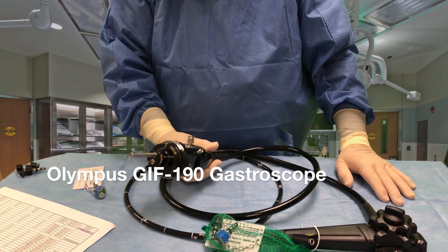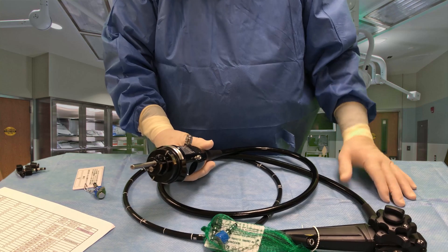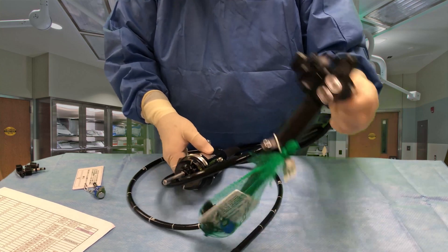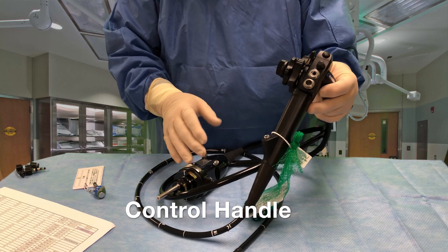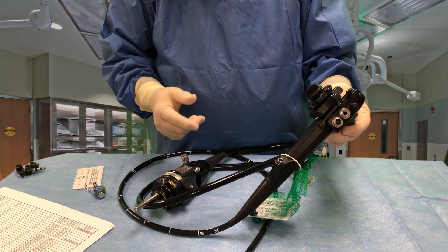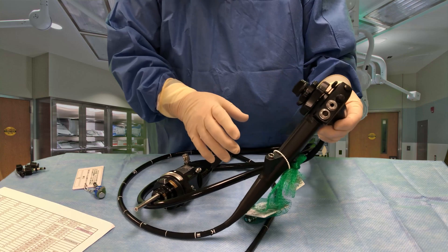The most noticeable difference between this scope and the 180 series is the electrical connector. But I'm going to start up here with the handle. The control handle is just like the other control handles on the 140, 160, and 180 series. There is almost no difference whatsoever in this control handle.